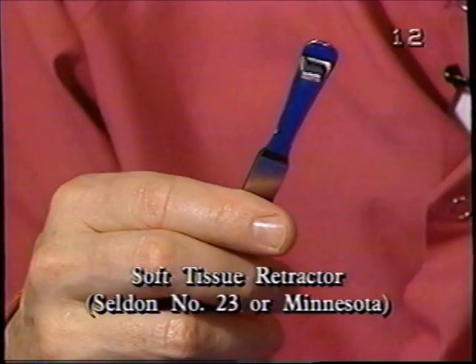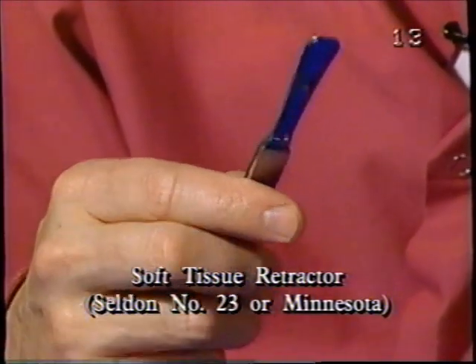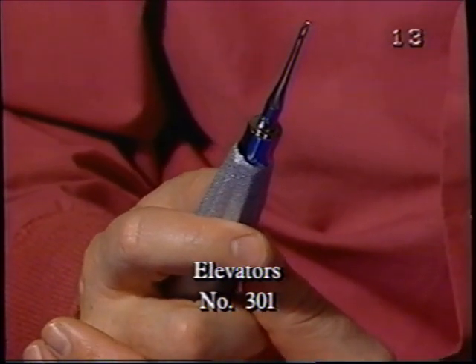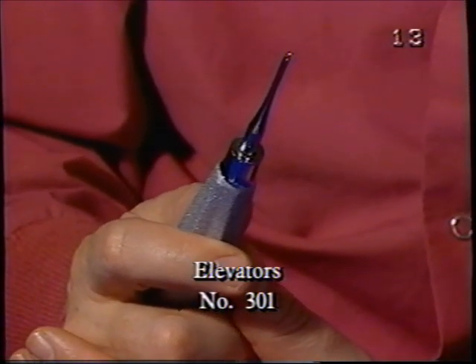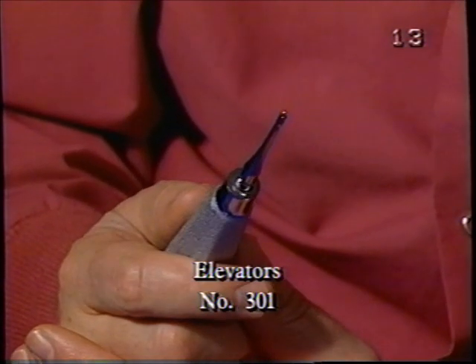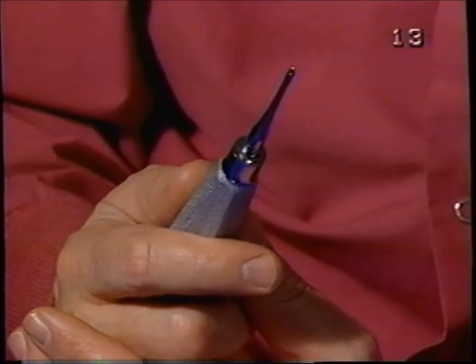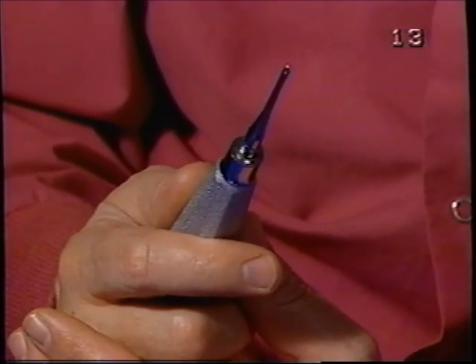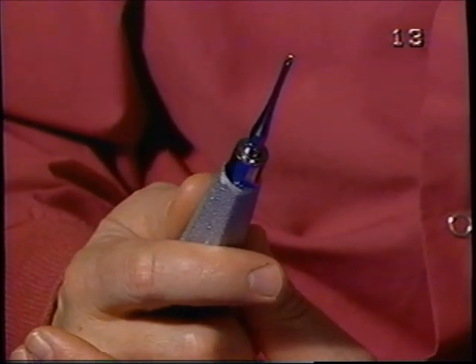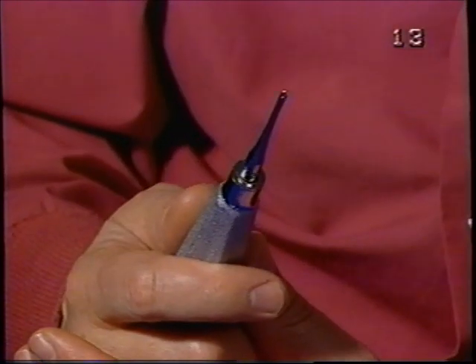This instrument is the Seldin number 23, your primary instrument to hold the flap back. The 301 goes hand in hand with that 702 burr. In fact, if you make a section cut in a tooth with the 702 or 1702 burr and you don't make it too wide, you can follow up with the 301 elevator. Put the 301 in the skinny way and turn it to the wider dimension, and it will cause the fracture that you want to separate a tooth in various parts.